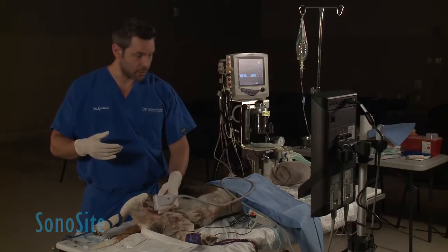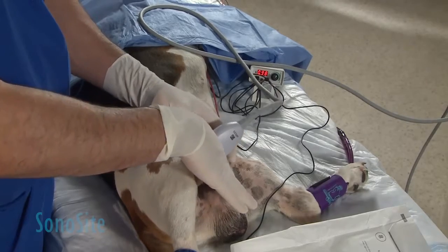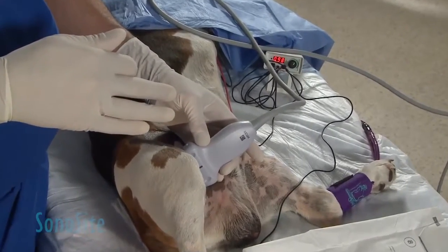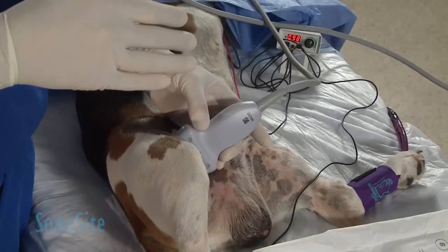We're going to be in-plane on this block, so what I'm going to do is identify my pectinous muscle. Once I do that, I'm going to be coming cranially to find my vascular bundle.